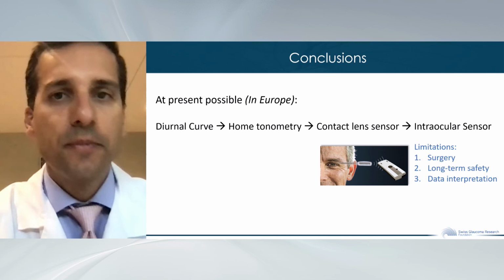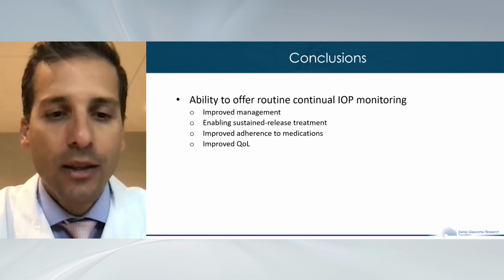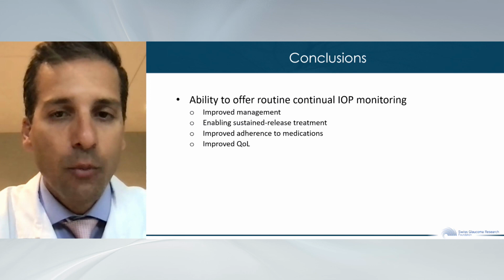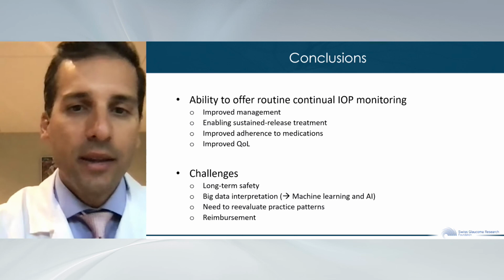However, I hope I showed you the importance of obtaining more than a single GAT measurement, and that we have devices that can help us obtain long-term data, and they will hopefully improve management, quality of life, and more importantly, adherence to medication, because now the patients are able to obtain IOP measurements themselves. Next slide. Some challenges remain, as I mentioned, but I hope we can address those in the coming few years. Thank you very much.